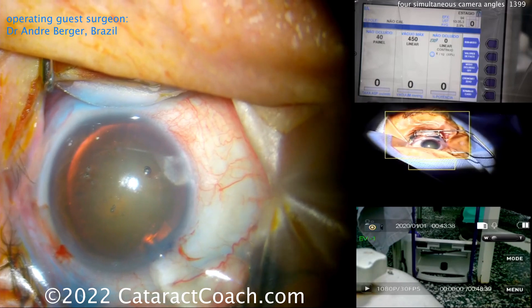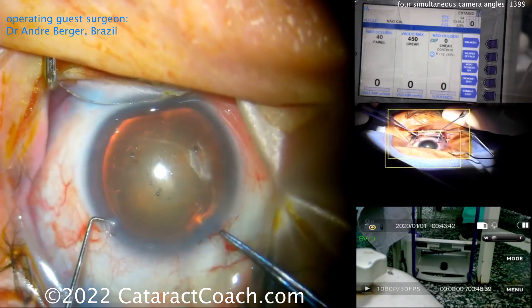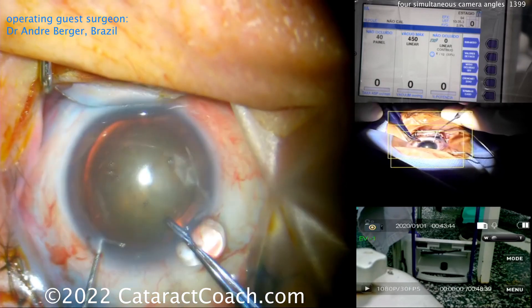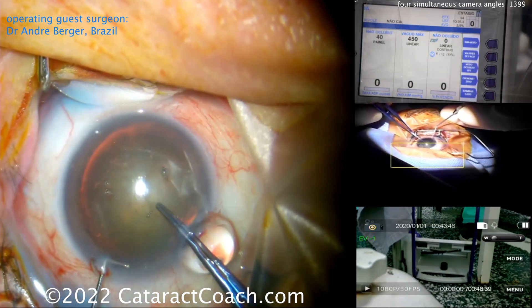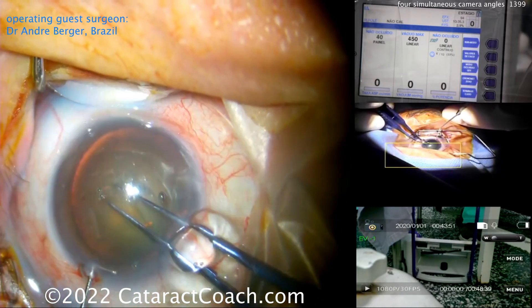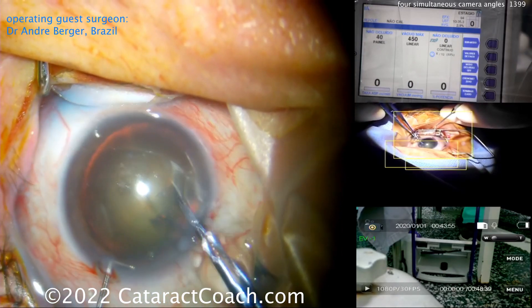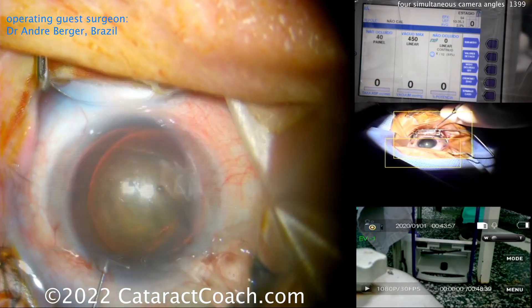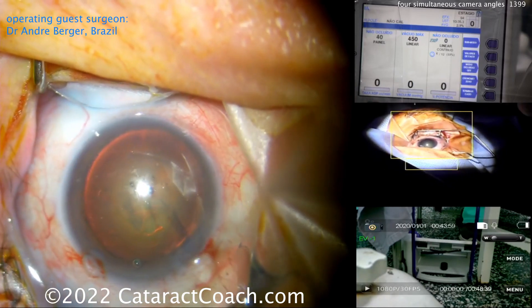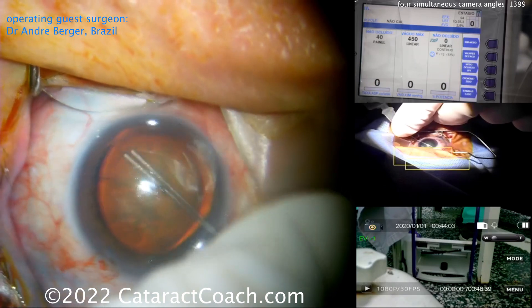By learning from these four angles you can see his approach to the instruments. Look at the middle frame on the right — you can see how the instruments are positioned in the eye. Notice how he's holding both instruments, right and left hand, like a pencil: fixating the eye with a chopper to give it stability while the right hand uses the capsulorrhexis forceps to create that five-millimeter rhexis. In the bottom right corner you can see he doesn't have his foot on the foot pedal yet.